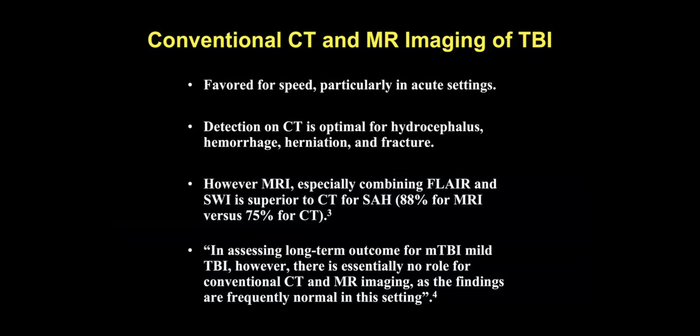Conventional MRI is better than conventional CT. Again, these are conventional structural sequences that we can evaluate with our naked eye as neuroradiologists. And neuroradiologists are trained to try to identify subtle lesions visually. But if it's not detectable to the threshold of the human eye, the radiologist, no matter how good they are, isn't going to see it. And of course, that's a lot of these injuries.